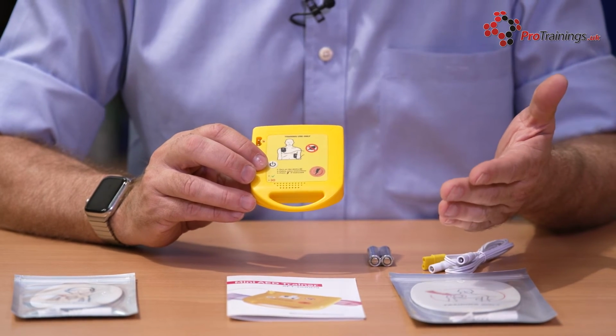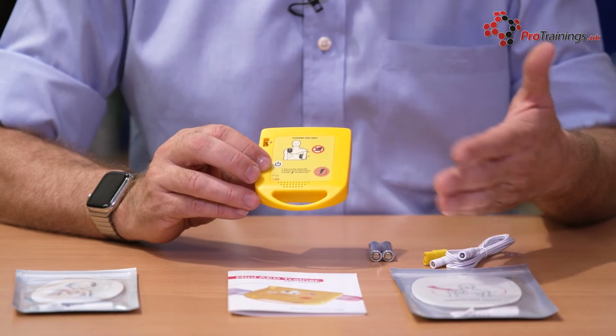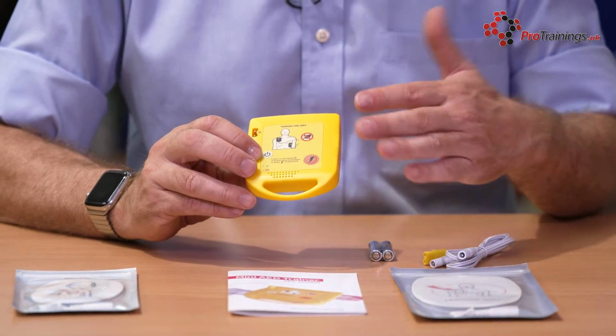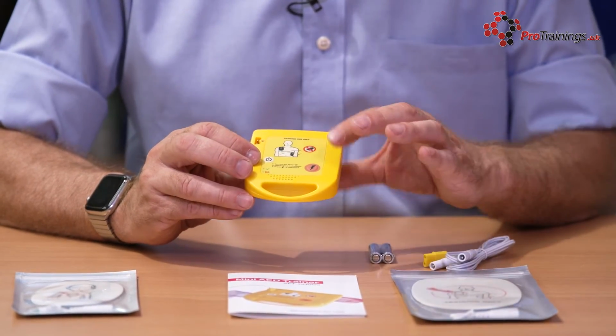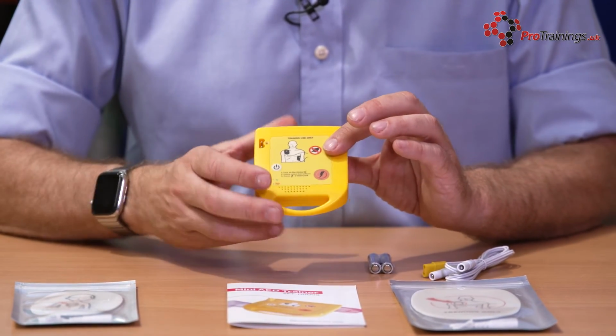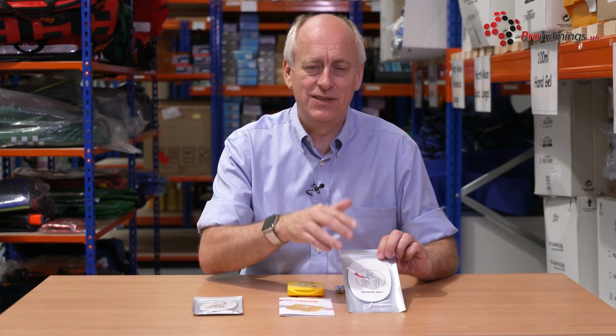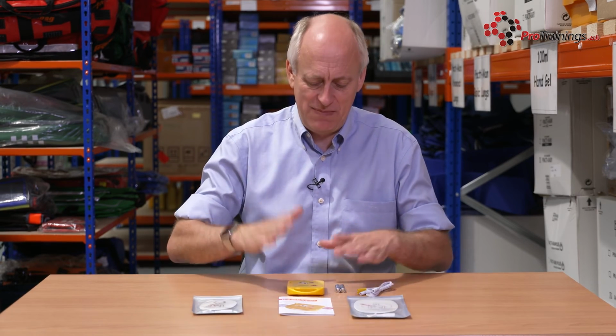Now, it doesn't have a metronome with it or anything like that. But 2 minutes later, it will say analysing heartbeat, and then that's the scenario done. With the unit itself, it is basic, but the key thing is when you're training, we're looking at training not only on the basics of using it, but the key, most important thing is putting the pads on in the right place. So by using this, you as the instructor can make sure that the student puts the pads exactly in the right place, plugs the unit in, runs through the cycle.